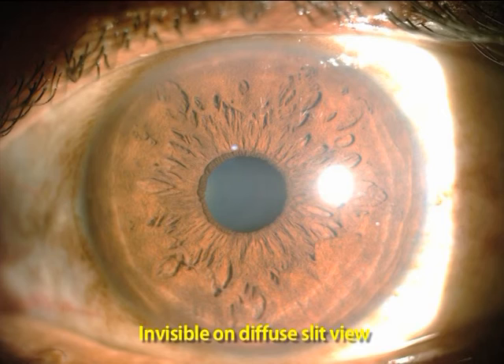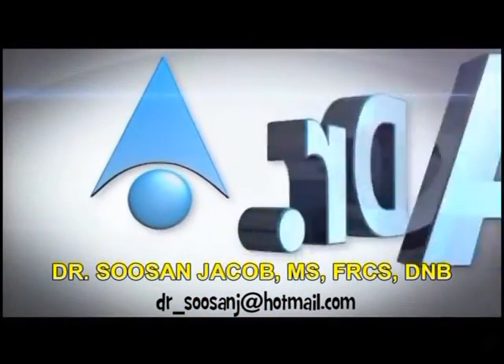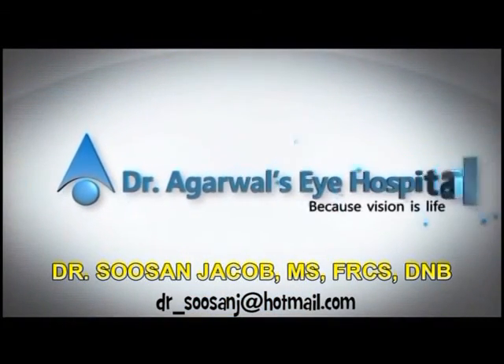This intrastromal lenticular implantation gives a hyperprolate shape to the presbyopic cornea, and thereby enhances the reading ability by increasing the depth of focus. I do hope you enjoyed watching this video. Thank you so much.